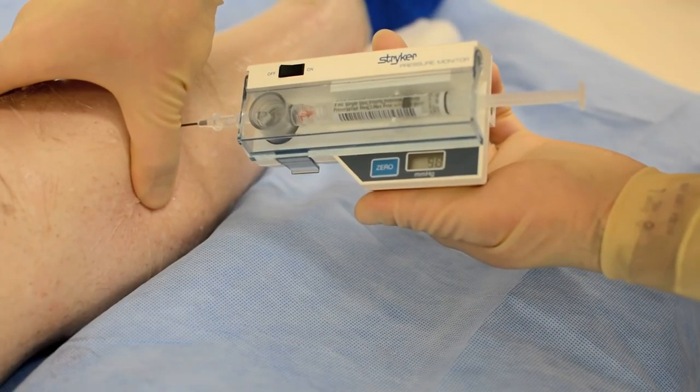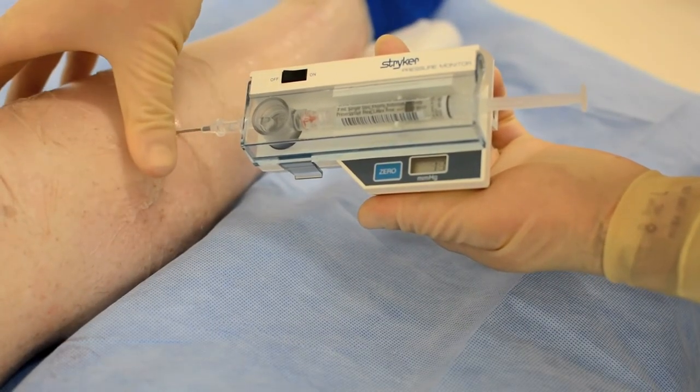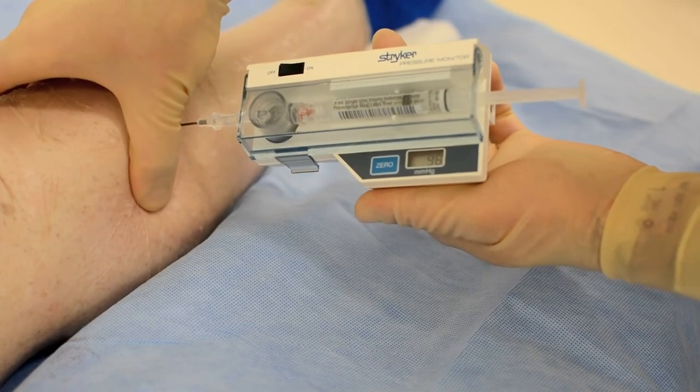Here is an example of palpating the compartment and the appropriate pressure change in the monitor.